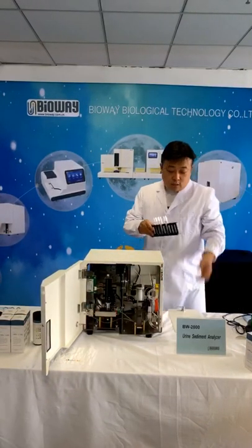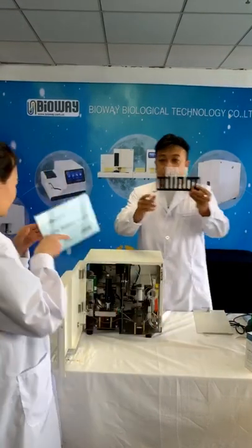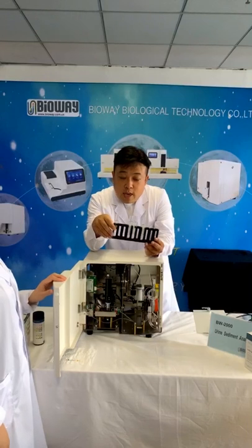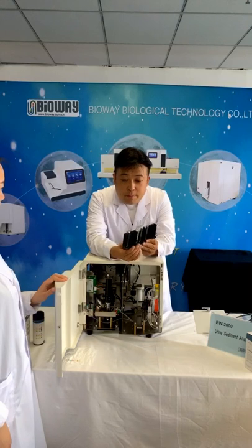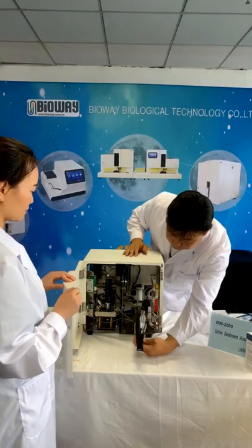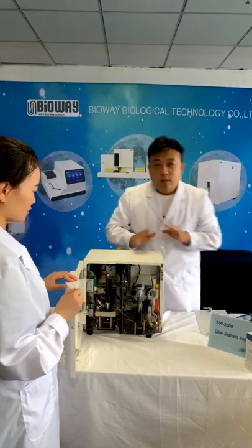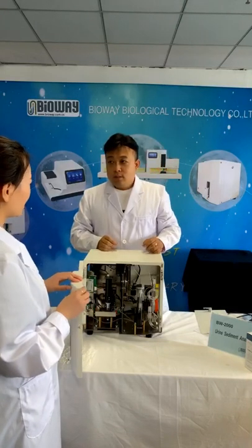Okay, now I will show you how it works. Normally, this is a rack for urine. The urine tubes go inside the rack, and the doctor puts in one rack each time, 10 samples, and puts the rack into the machine. Pull it to the end of the track, and then close it. Just press start on the monitor, that's all.